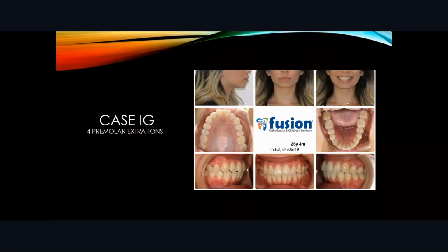The second patient I'm going to show you is an extraction patient. The patient had Invisalign before and came to me as a transfer. She wasn't happy with her profile, the proclination and protrusion of the teeth. So we decided to do an extraction treatment for her.